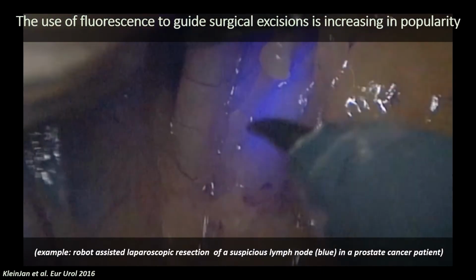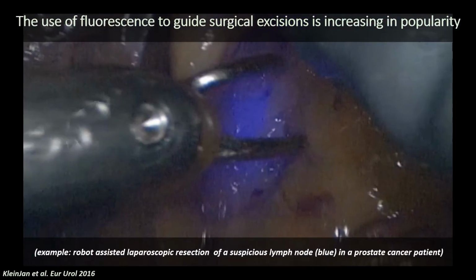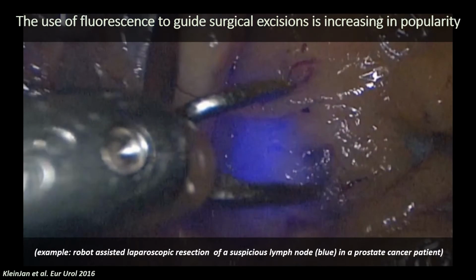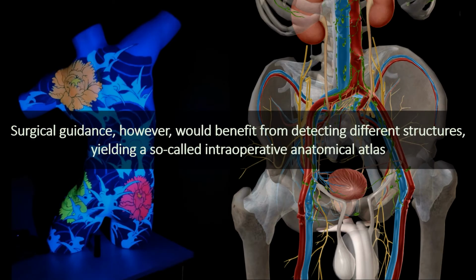This movie shows you an example wherein a Karl Storz fluorescence laparoscope allows for clear delineation of a sentinel lymph node in a prostate cancer patient. Given the complexity of the patient's anatomy, it is not logical to assume just a single fluorescence signal is enough to address all the surgical challenges. In fact, one may even say we underestimate the complexity of surgery when we state that mere fluorescence illumination of one aspect in the procedure is enough to improve the procedure as a whole.